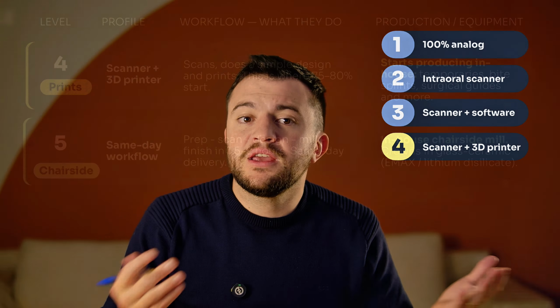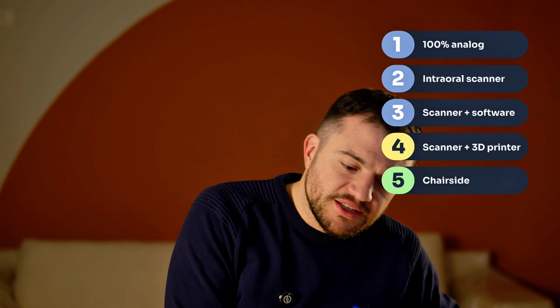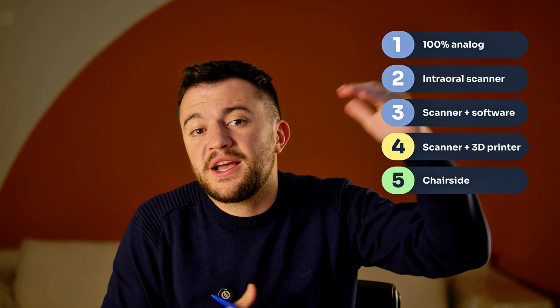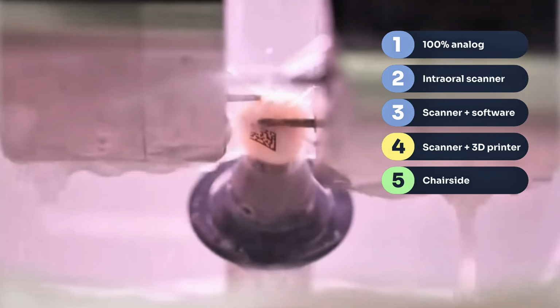What would be from here the logical next step? It would be to get into chairside dentistry. These are the CEREC doctors, the doctors that are doing e.max or lithium disilicate in-house. So they prep, scan, design, mill, and finish all within an hour and a half, 2 hours, and they have this same-day workflow. This has grown a lot in the past. I think now it has plateaued, but it is definitely the next step for someone that has a printer, to have a chairside mill in-house.